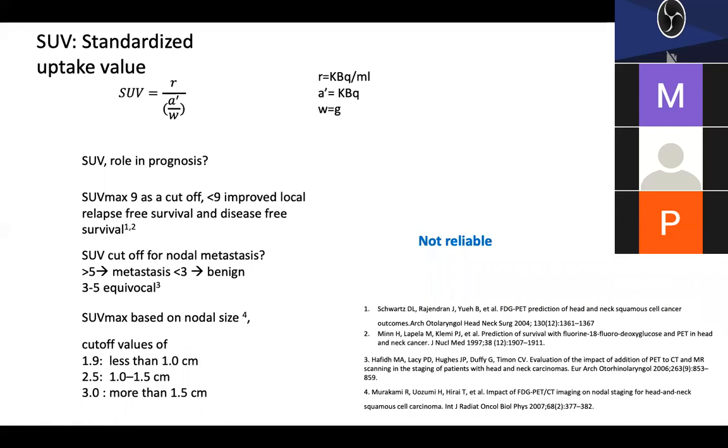Okay, ma'am. For nodal metastasis, various studies have shown CT sensitivity of about 60%, and PET is 70 to 80%. And some studies have even shown that PET has a sensitivity for detecting nodal mets of up to 90%. So it varies, but it is significantly higher than CT in all the studies that have shown, compared with a plain CT scan.